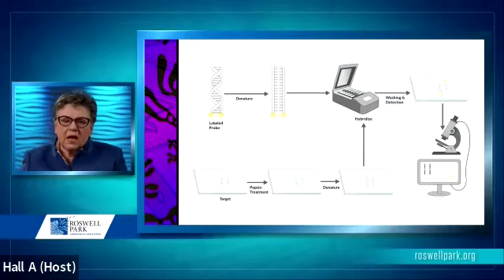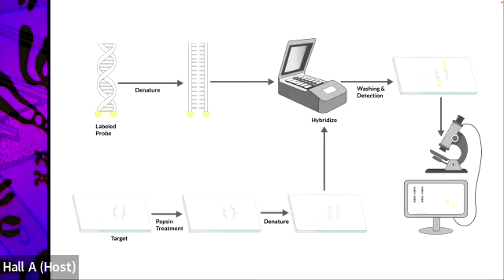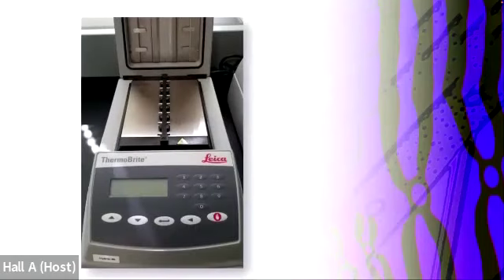The example that we have here is actually a piece of tissue. We can use formalin-fixed paraffin-embedded material as well as material that we've already used for the chromosome analysis. The material is denatured using a denaturation apparatus and washed with several different solutions, which will then allow us to visualize the image through the fluorescent microscope.